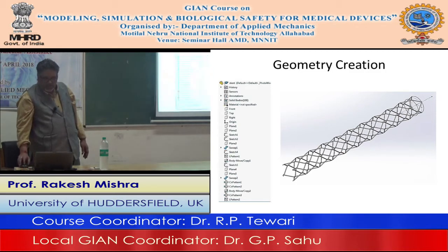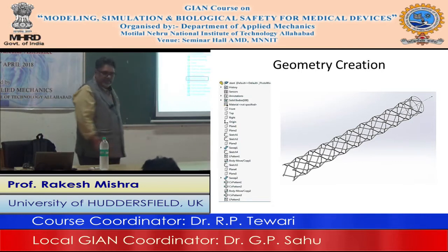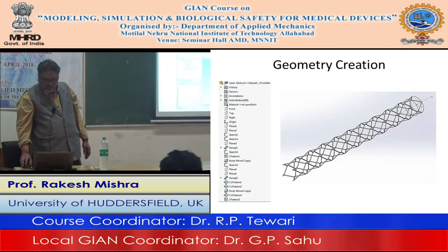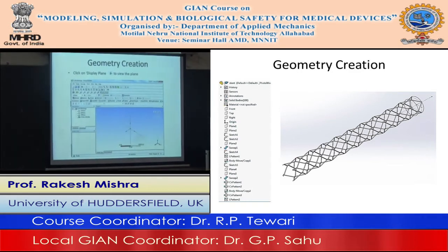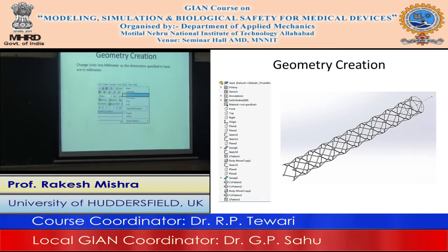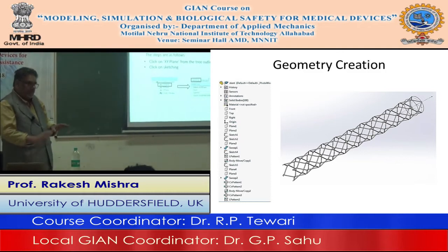Then we start ANSYS like we did every day. Start ANSYS, bring Fluent back here. So Fluent has come here, and then we double click on Geometry, and Design Modeler will open. A new window will open, and here first we create the display plane by clicking on the display plane icon, and once that is done, like we did every day, we change units to millimeters, and then we create the complex artery.